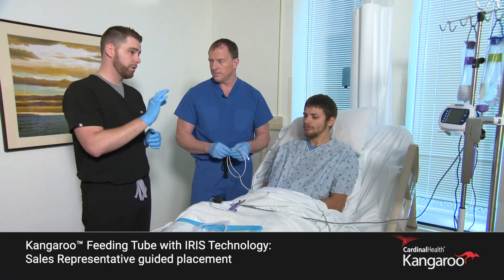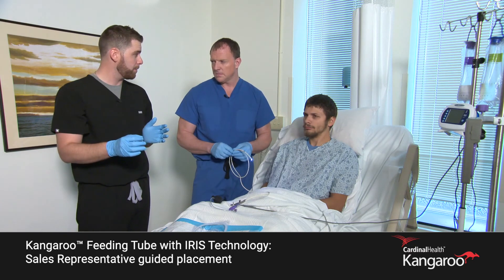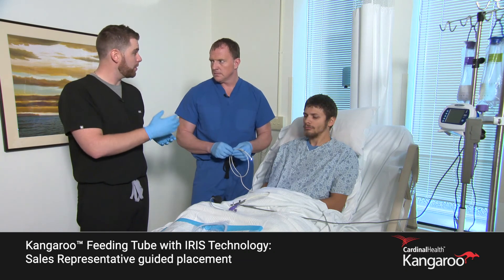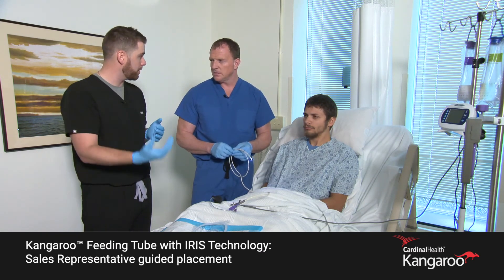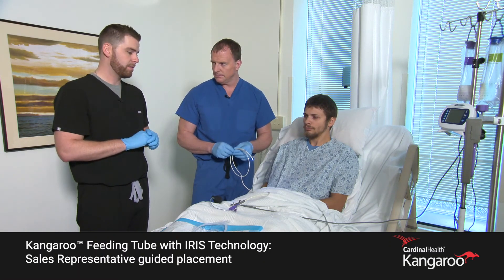Once we confirm we're in the esophagus, we'll advance to the 50 centimeter mark. Around that point we're looking for the stomach wall rugal folds. Once we confirm that, we'll advance to 70 centimeters, where we'll look for the finger-like projections of the small bowel. Post-pyloric placement is our goal. Any questions?